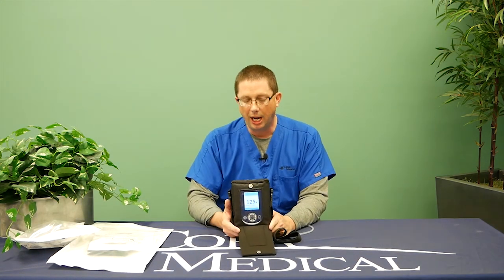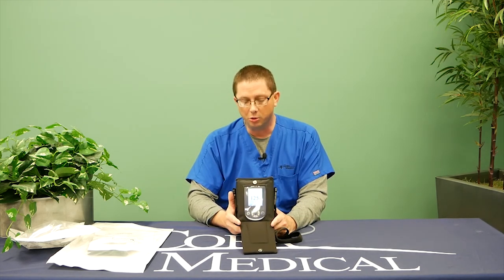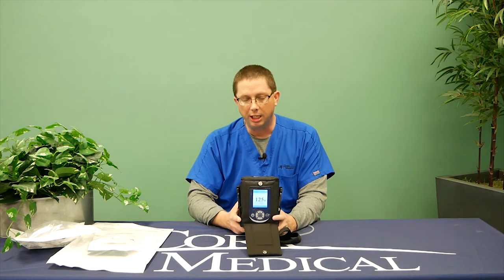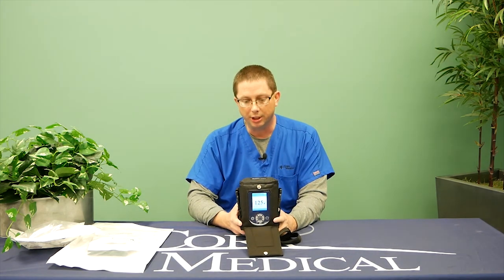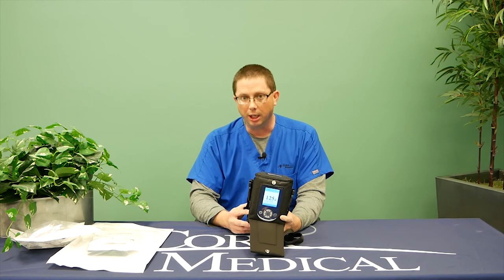A couple of housekeeping items: make sure you keep your pump dry and don't drop it. If you submerge this pump in water, immediately disconnect power and call Cork Medical to have a replacement pump sent out. Always keep it in the black bag unless you're changing the canister, and always remember to charge the device while you're sitting down.